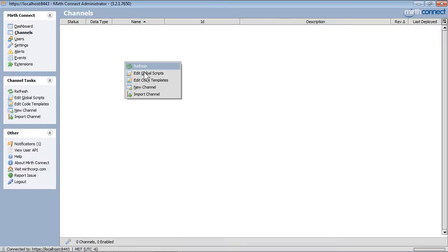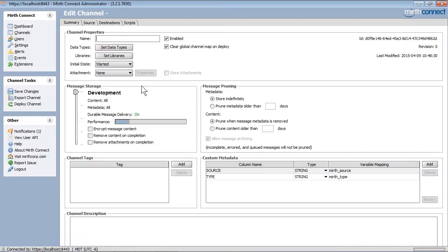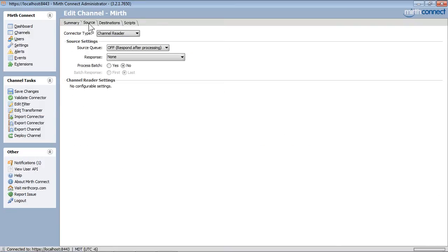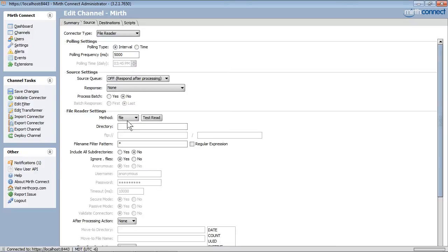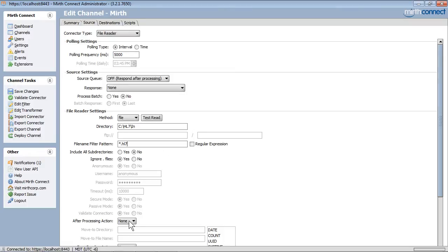In Mirth, we will create a new channel and give it a name. Then we will specify the inbound directory and a filename and extension. We will also configure it to delete the message after it picks it up.